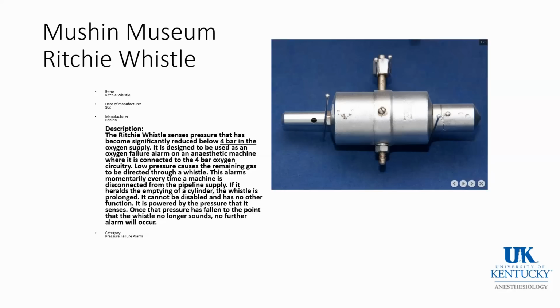And as anesthesia machines became more complicated, more complex, such as the Narkomed by Dräger and the various lines of anesthesia machines by GE, Ohmeda, etc., these add-ons or these Boyle's apparatus machines had their own oxygen supply failures.